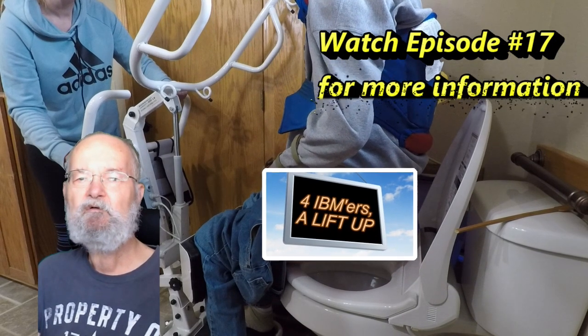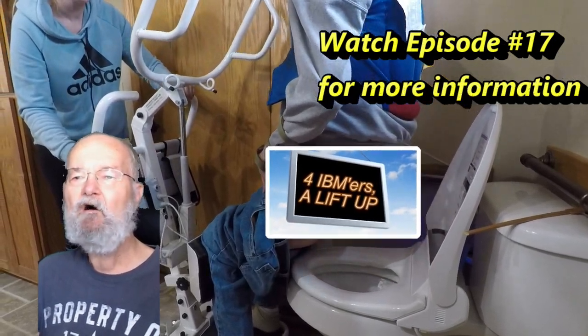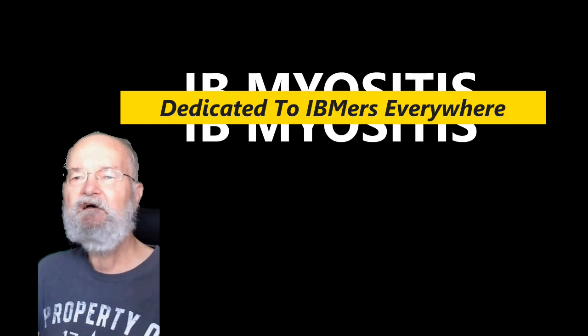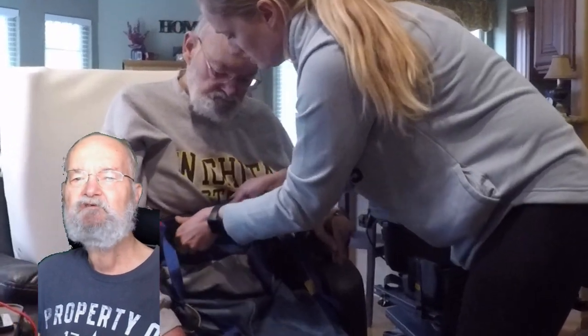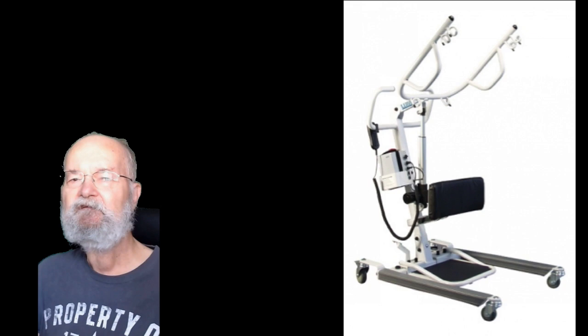An improper sequence of events, including incorrect sit-to-stand lift setup or poor positioning of the sling around my body, can result in a dissatisfying experience. So I shall attempt to explain how I've successfully set up the sit-to-stand lift and how to adjust the sling to accomplish an easy, safe, and painless transfer, as well as show some other benefits that I get from using the sit-to-stand style lift.